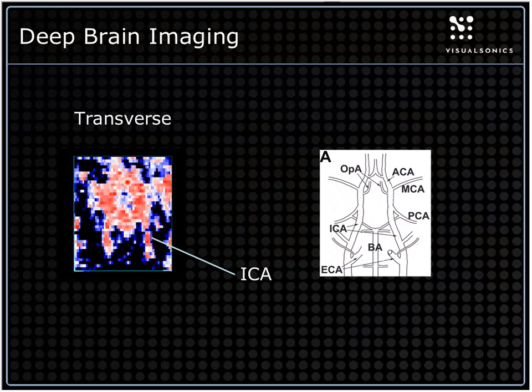And if we zoom in on that bottom part of the brain, we can identify the circle of Willis and different things, possibly even the middle cerebral artery, the internal carotid, certainly. And this is important too, again, for stroke studies and things like that. Now, to my knowledge, this hasn't been done before either. So even though it doesn't look like much, I think this really does have a lot of implications for doing a lot of really interesting work.